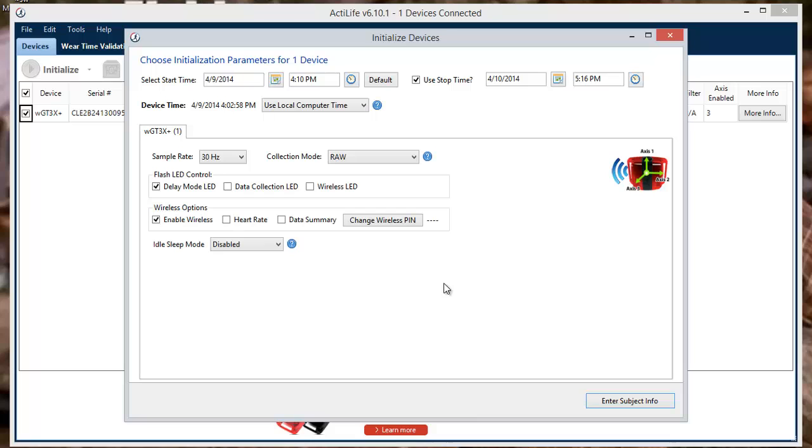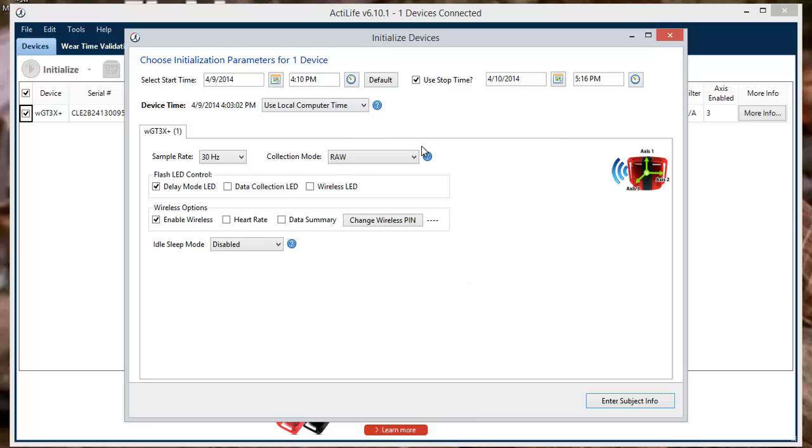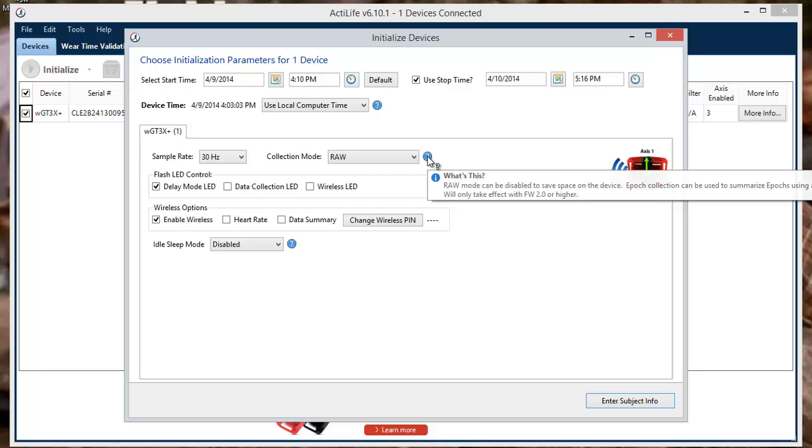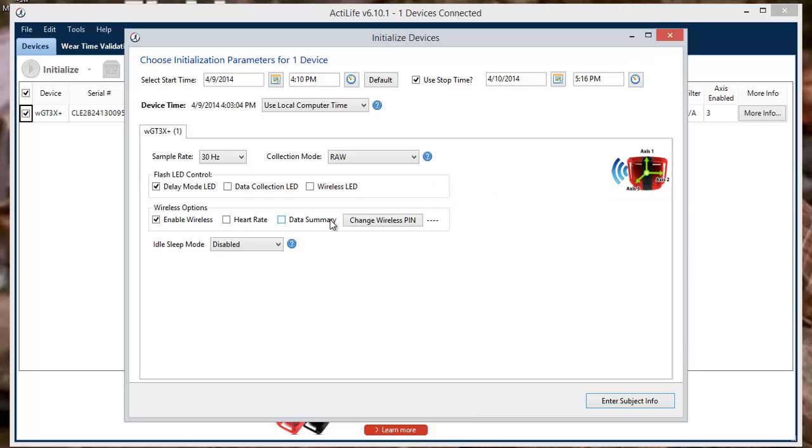Please note that anything not covered in this video can be explored by clicking the blue question mark next to the parameter. This will take you to our help page for additional information.